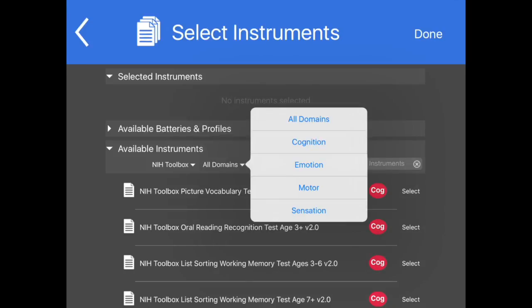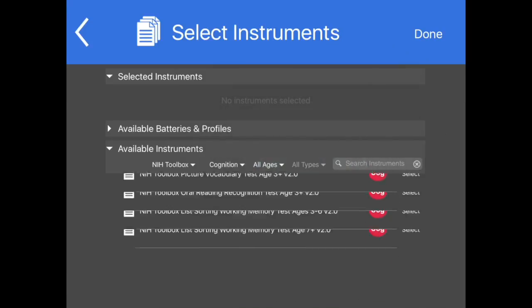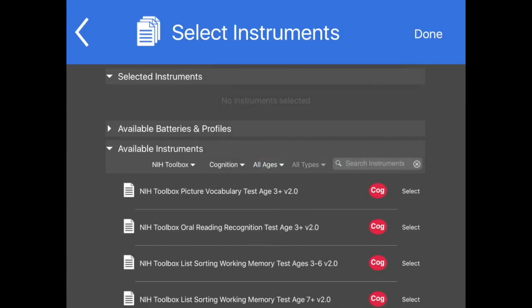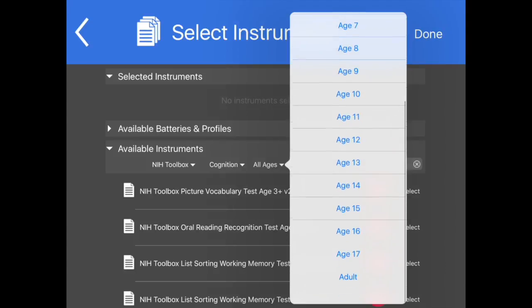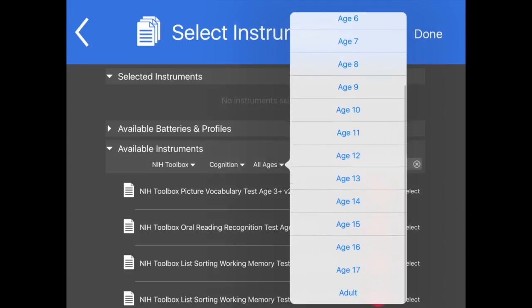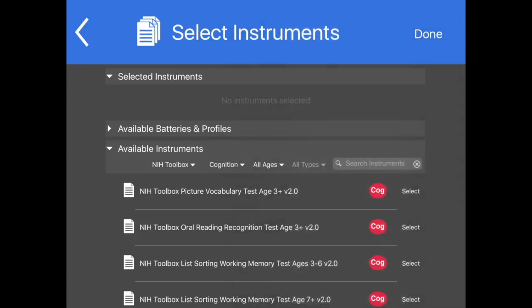Users can filter the list of available batteries and profiles as well as the list of available instruments by tapping arrows and making selections from the following categories. All Domains: Cognition, Emotion, Motor, Sensation. All Ages: Ages listed individually from 3 to 17 or adult. Or all types: CAT, Short Form, or Fixed Form.